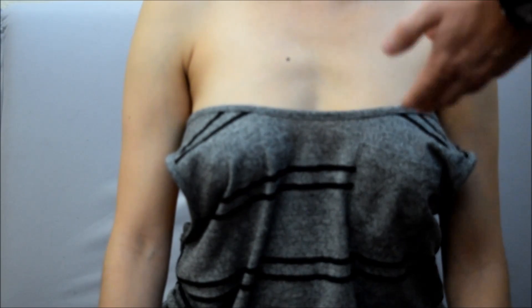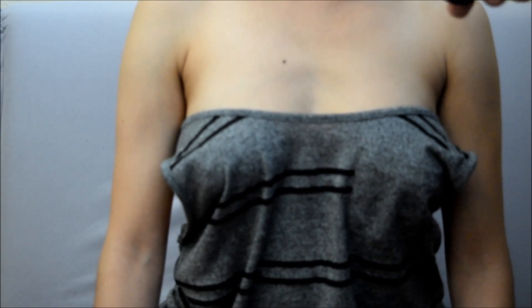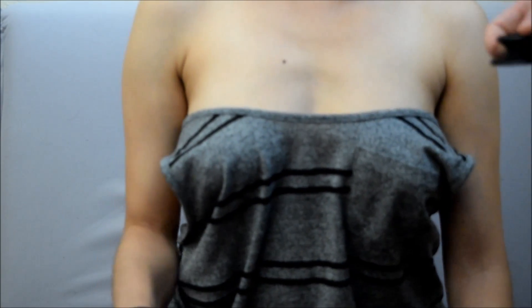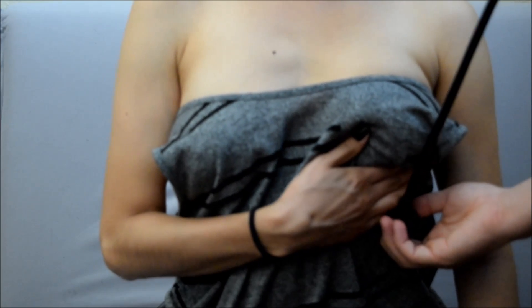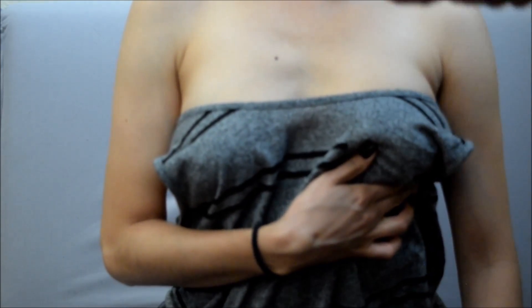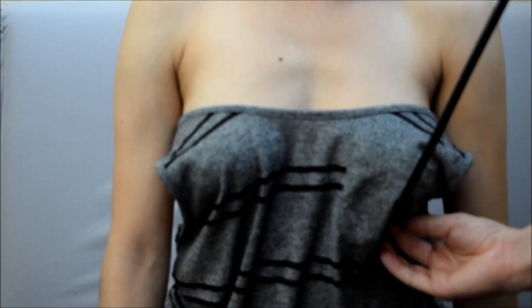If you're a male provider in this situation, you can always tell the woman to lift up her breast so you can listen underneath. Or if she can't do that — if she's immobile or anything — you can take your stethoscope and just push up and listen.